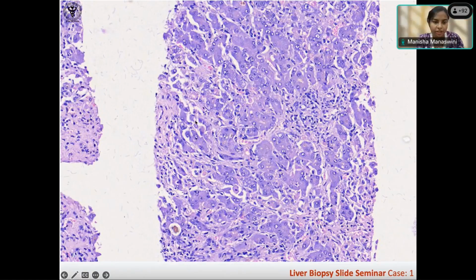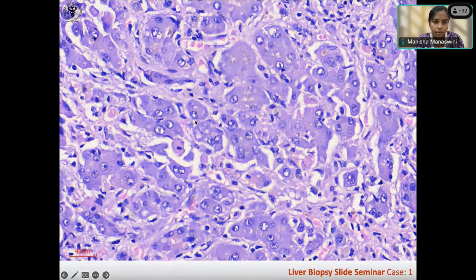Bile plugging. Very good. You're finding actually these are holes, but you're finding something dot-like which is greenish or brownish. This is actually intrahepatic cholestasis. Small cholestasis there. And then somebody was asking about apoptosis. See, this is an apoptotic body.